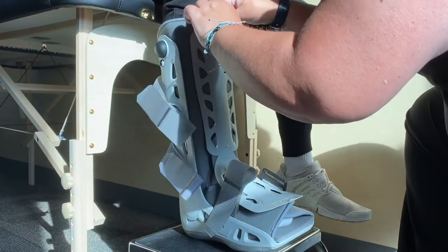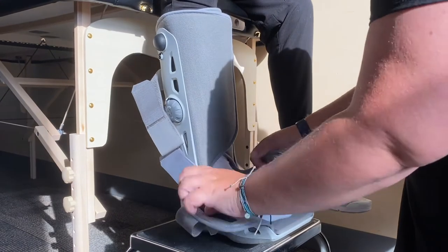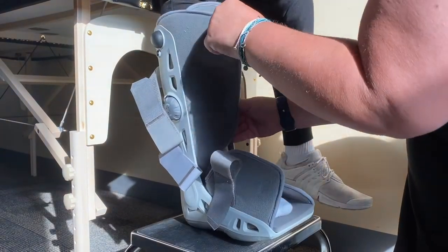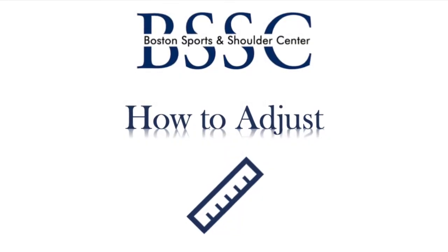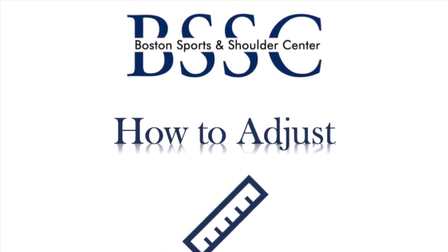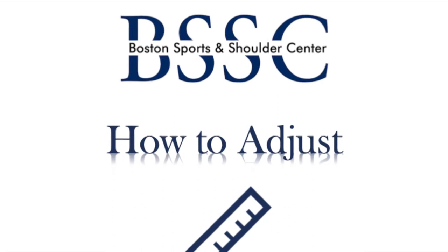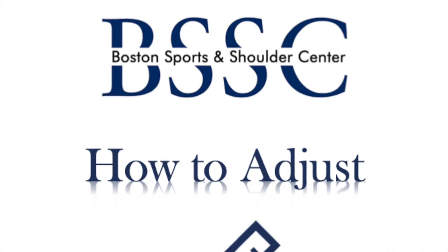To remove the boot, unfasten the straps, remove the protective front panel, open the liner, and gently lift your foot out of the boot. If you feel numbness or tingling in your toes quickly after applying your boot, you may have fastened the straps too tight. Or, if you feel your foot is sliding forward, your straps may not be fastened tight enough.